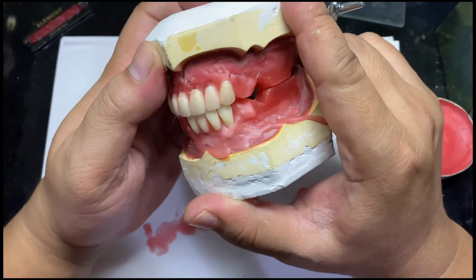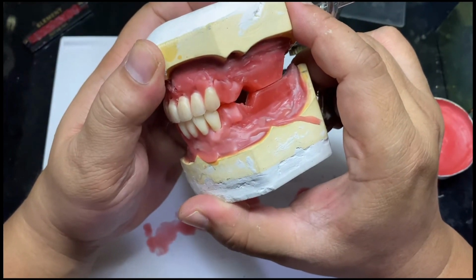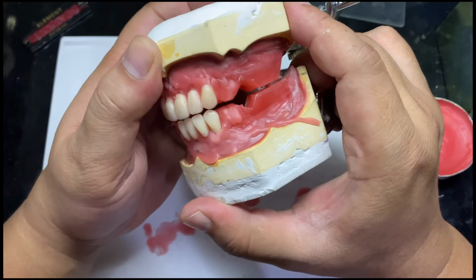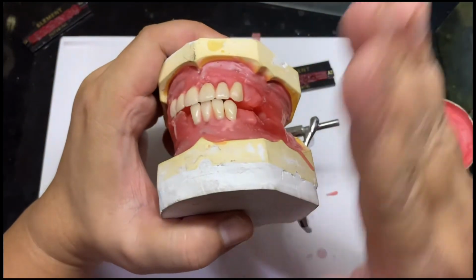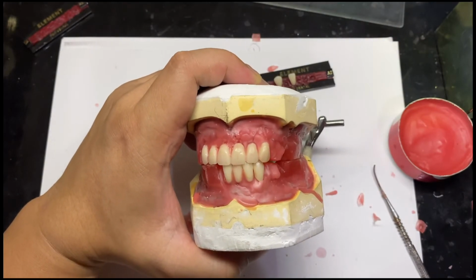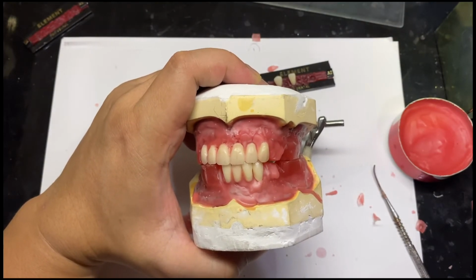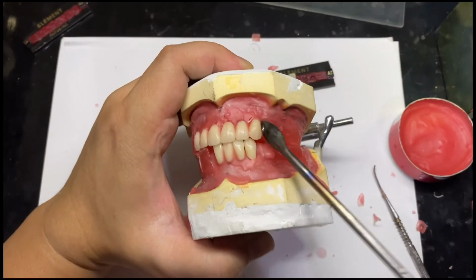The mesial slope of the upper K9 falls on the distal slope of the lower K9. So I'll just try to adjust a little on the K9, just to lessen the amount of overjet.